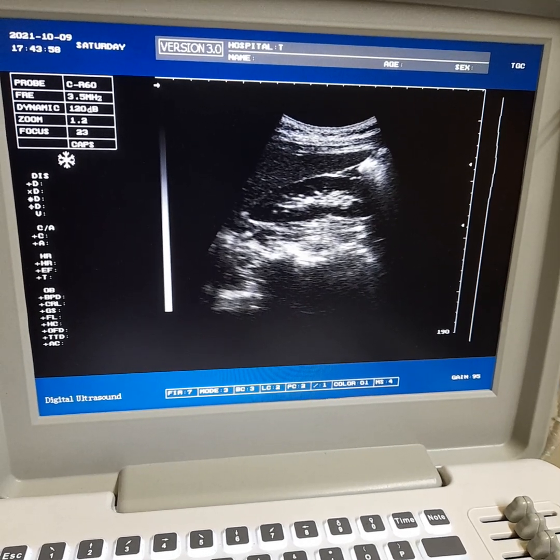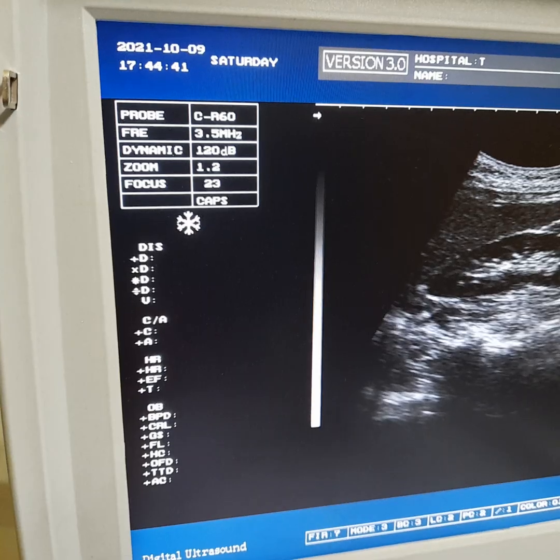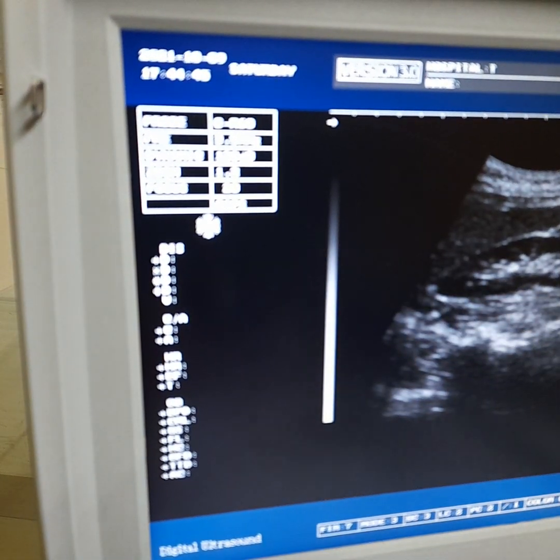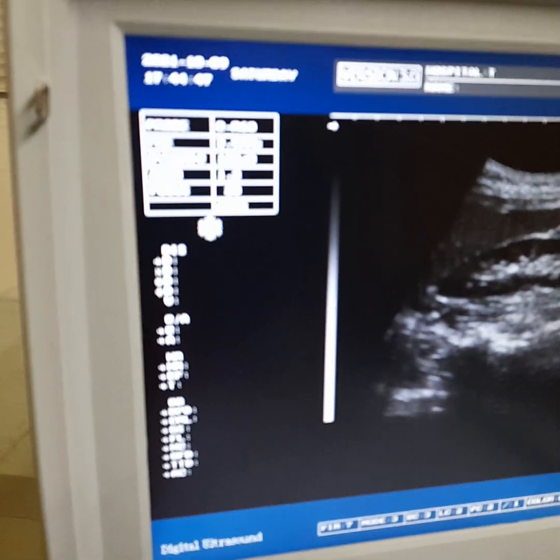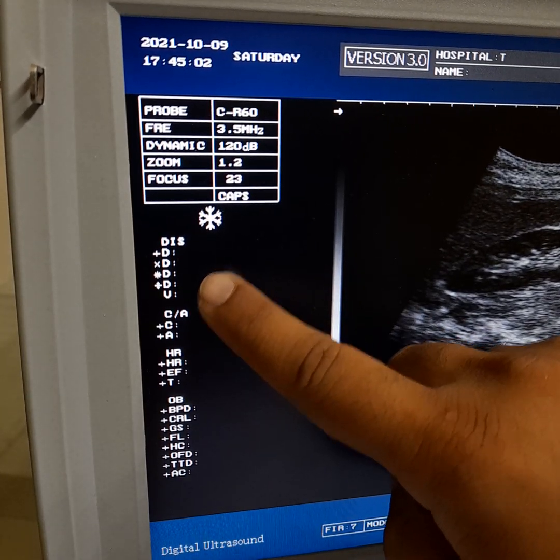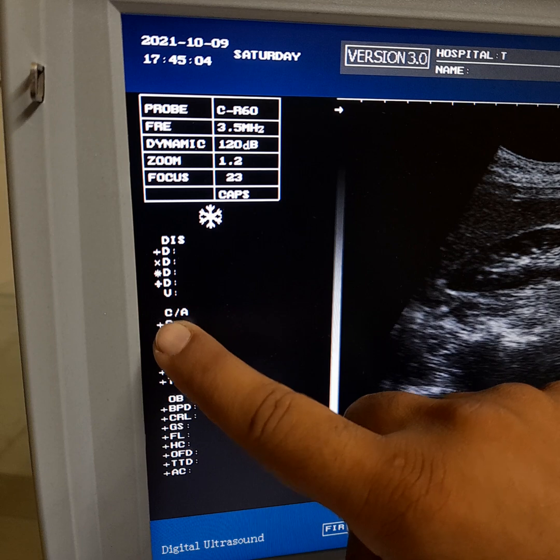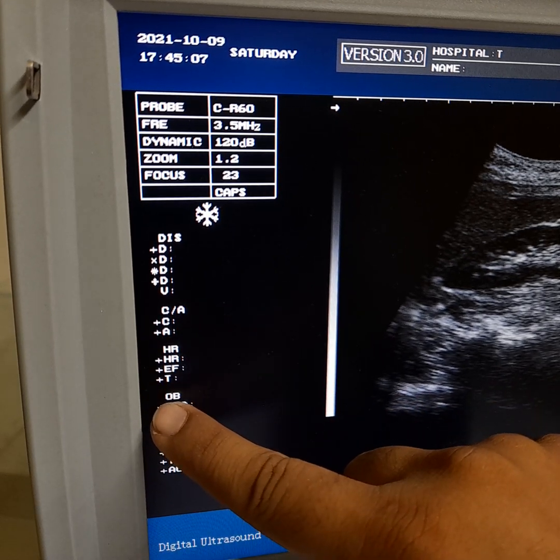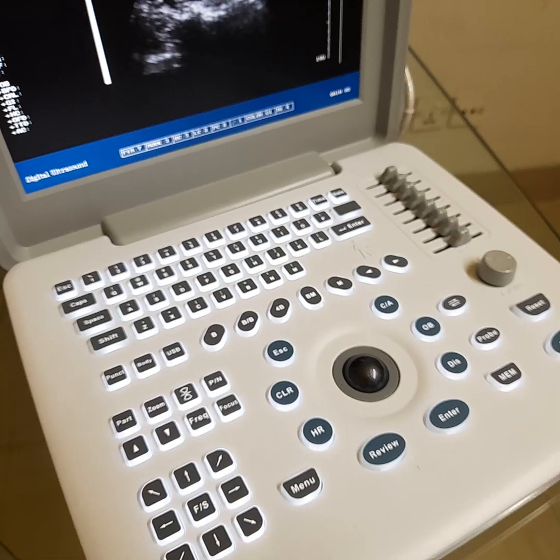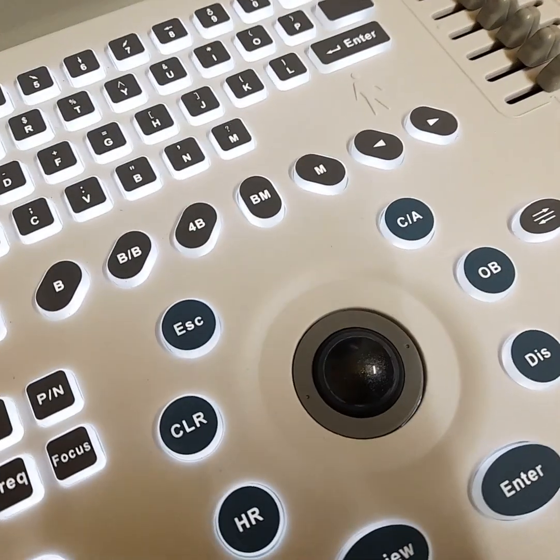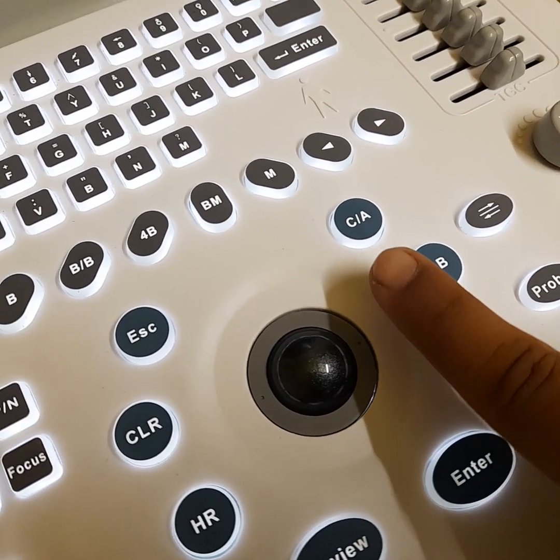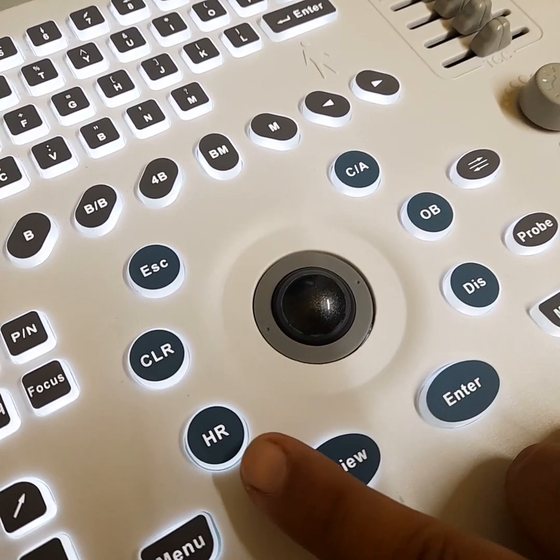Apollo 7 measurements. The available measurement types are: Simple Distance, Circle Area, Heart Rate, and Obstetric Measurements.